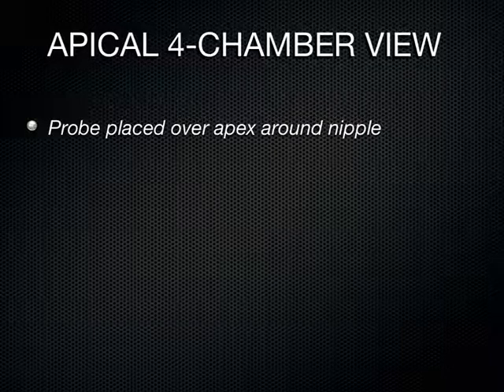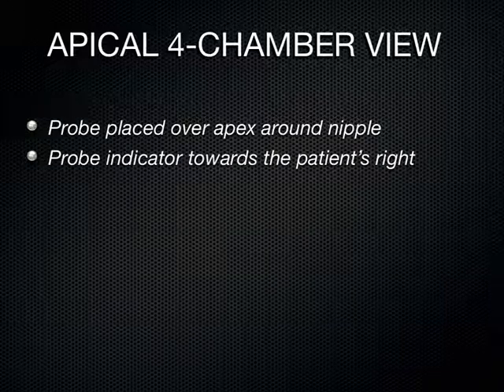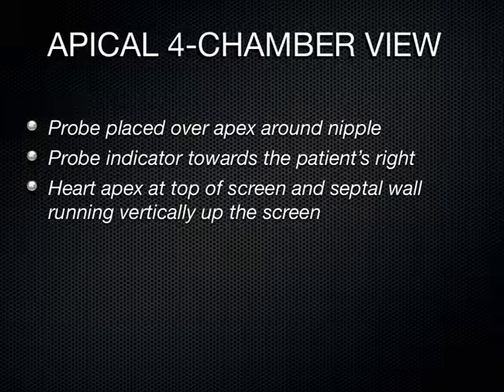It's particularly difficult in women with large breasts because you've got to move their breast out of the way to get to this little view here. So this is one you're going to struggle with to obtain, but it's the one that gives you the most bang for your buck. You're going to place that transducer just inferior to where the nipple line is and lateral, in that area down there by the nipple. And you're going to have the indicator to the patient's right.